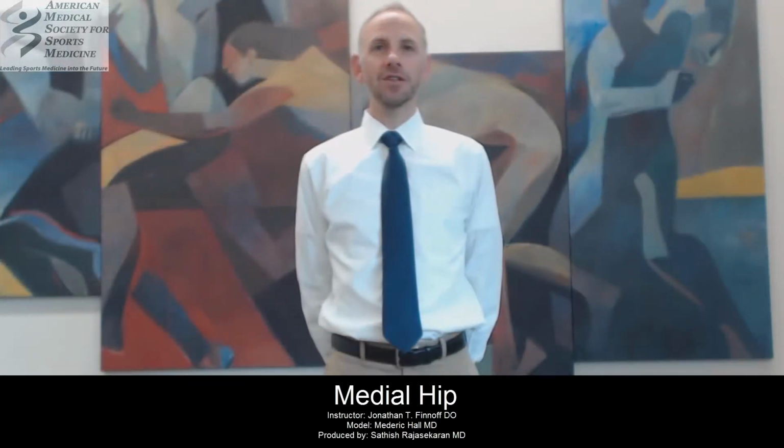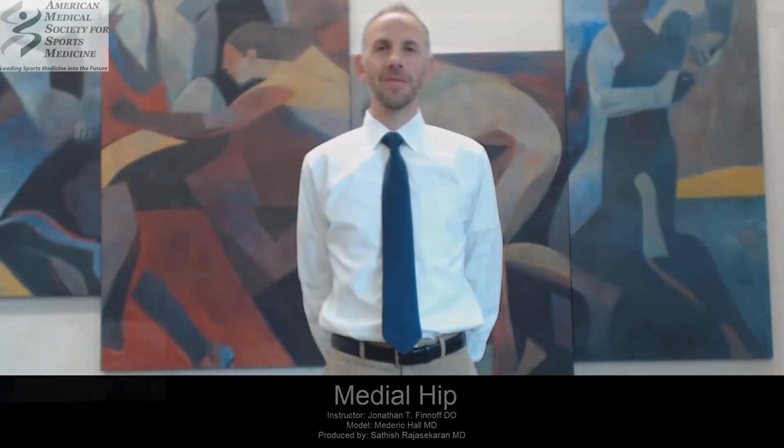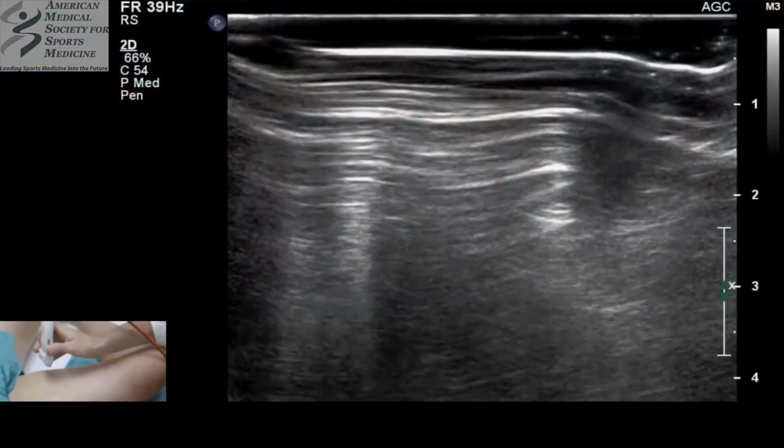I don't have any disclosures, but I do have a disclaimer. This presentation is not meant to be a comprehensive review of this topic. Our objective is to cover the core competencies as outlined in the AMSSM recommended sports ultrasound curriculum for sports medicine fellowships. We're going to do a medial hip examination.